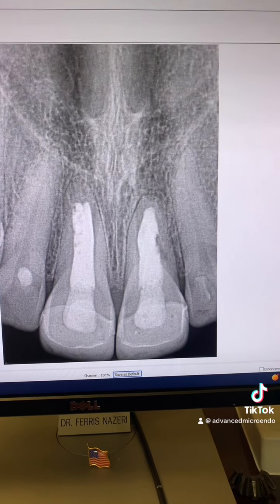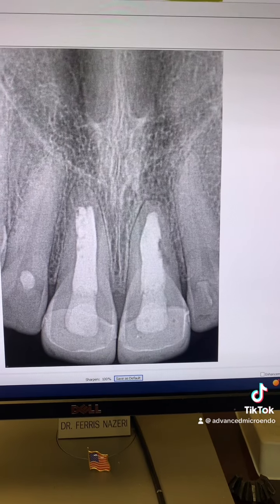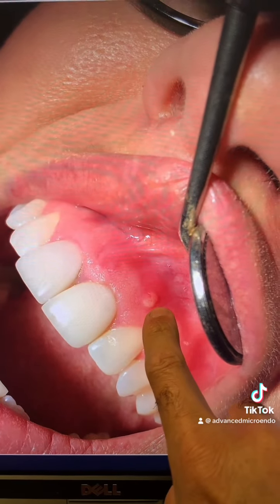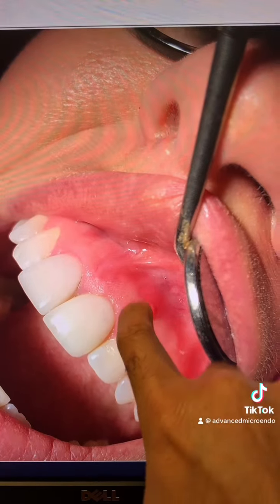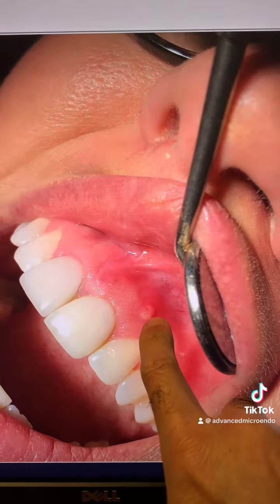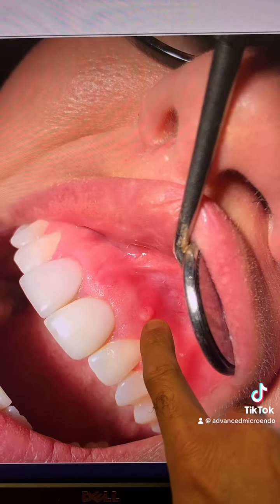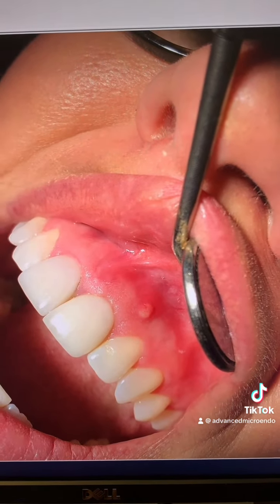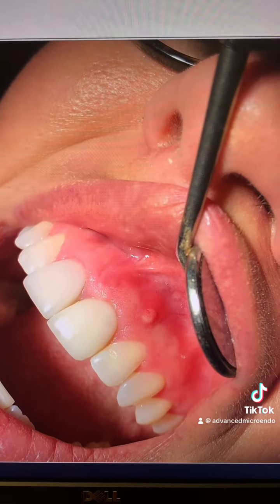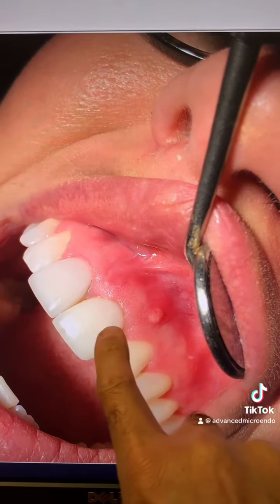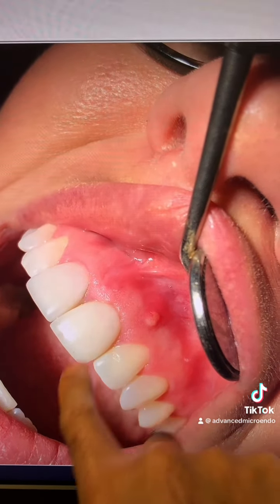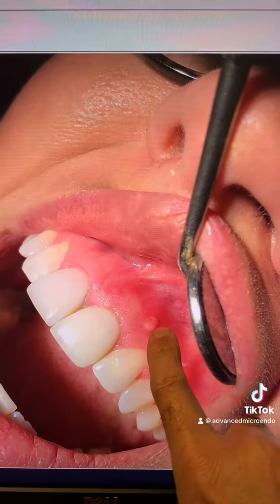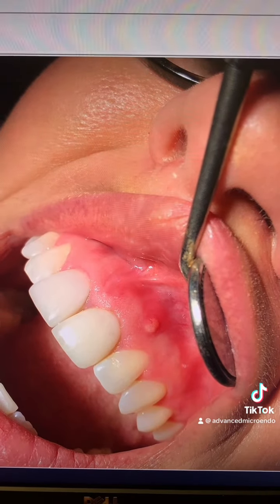A few days ago, she noticed what she called a pimple on her gum right there. That's the sinus tract, of course. And that's the tooth right here, and the sinus tract right there.